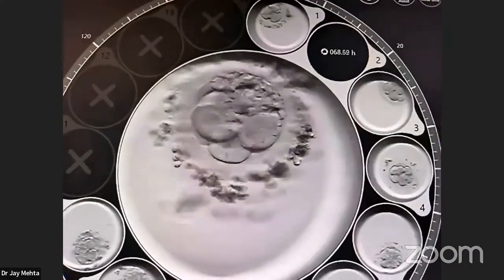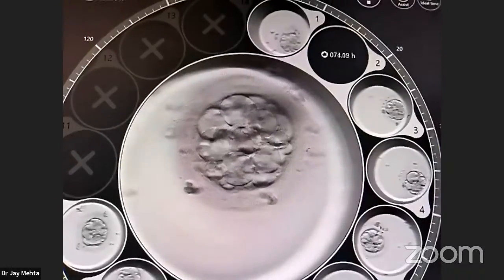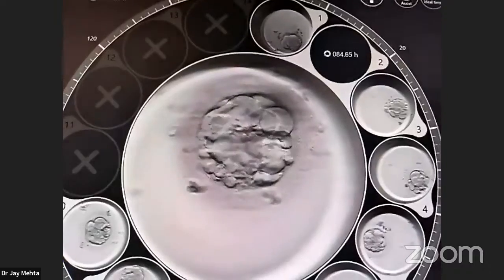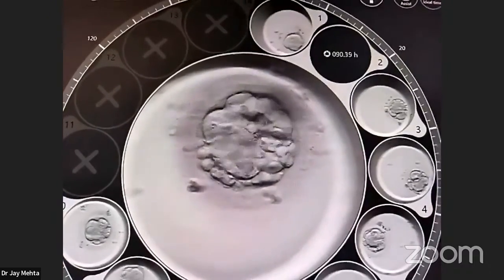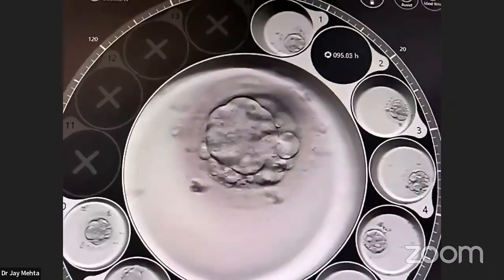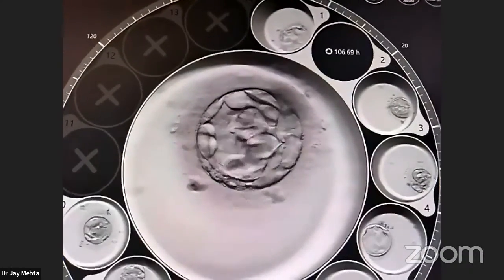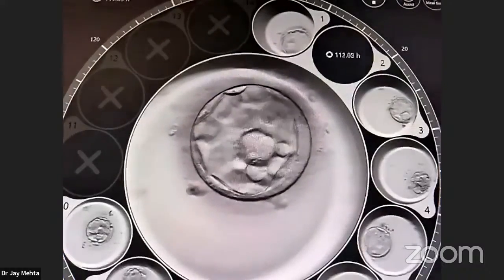At approximately day 3 stage, here we are about to be on day 3 stage. It is a developed 8-cell embryo, but it is severely fragmented. Despite all this, it has gone into a morula stage. And you will see that from the stage of morula, see how beautifully the embryo just autocorrects, and it has given rise to an excellent blastocyst.